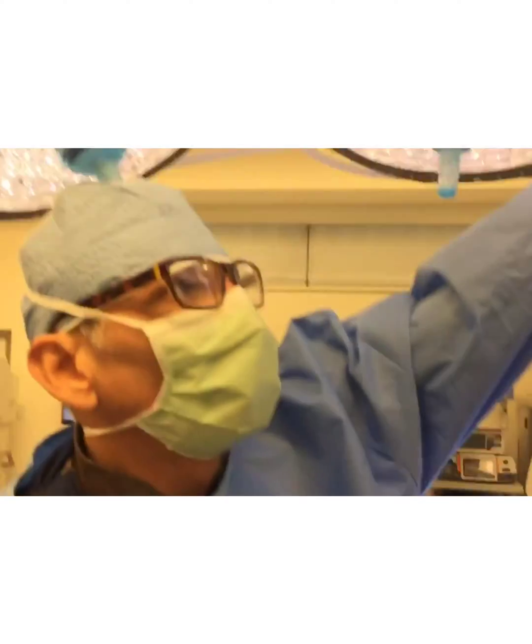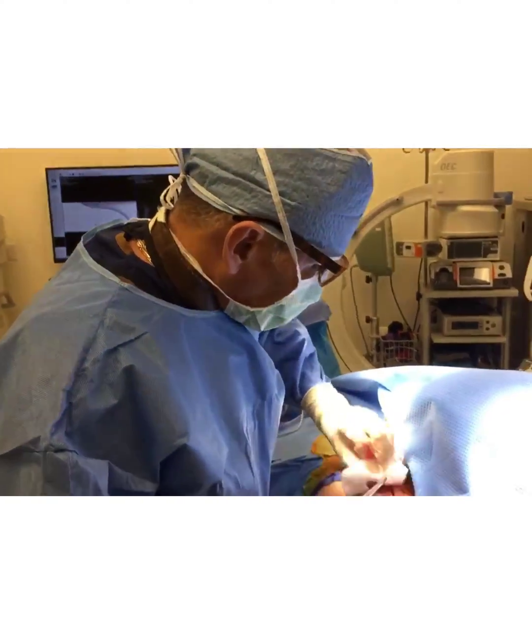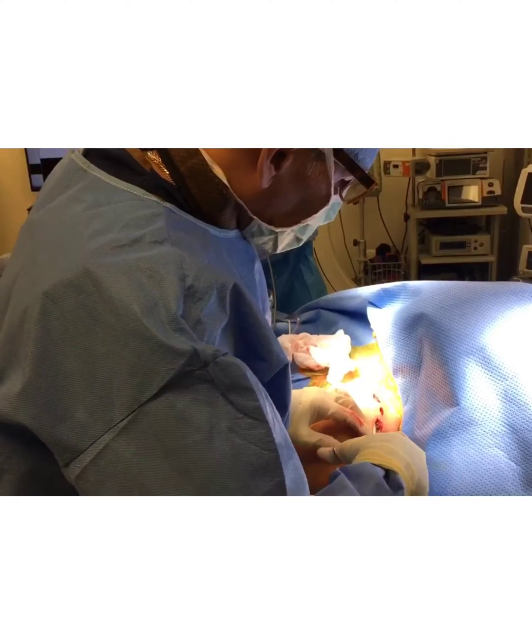Dr. Mora here, doing a hardware removal. Why are we doing a hardware removal? We don't always have to. But this is the clavicle plate — the patient is very thin, and any pressure over this is causing him a lot of pain.